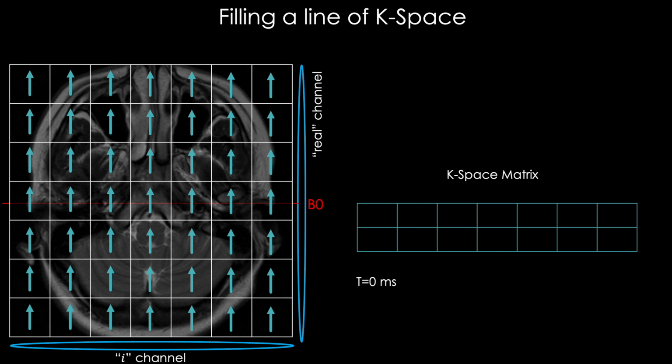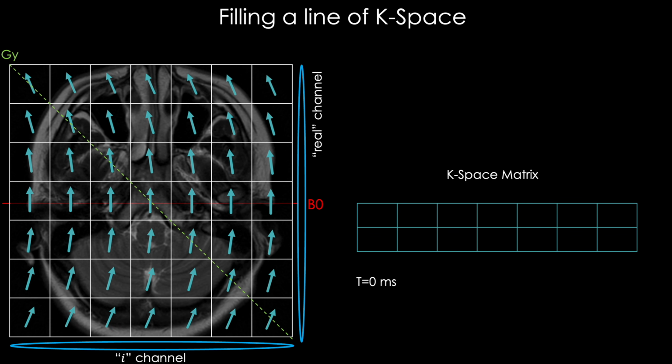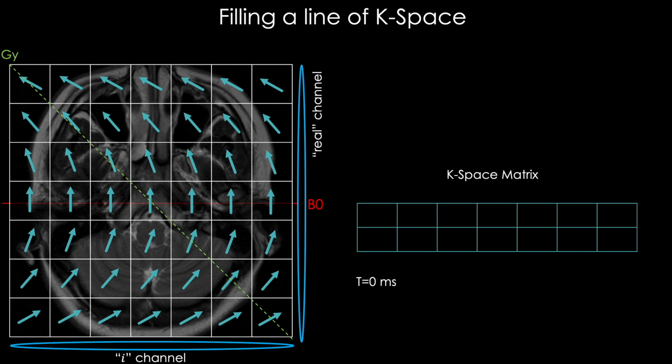We start with our RF pulse as usual, but now we'll apply our other gradient, GY, using a strong magnetic field across the y-axis for a chosen duration of time. This will cause dephasing along the y-axis as shown, until we turn the gradient off. We then do our usual tricks to generate an echo, and then once again turn on our GX gradient and begin recording the signal.